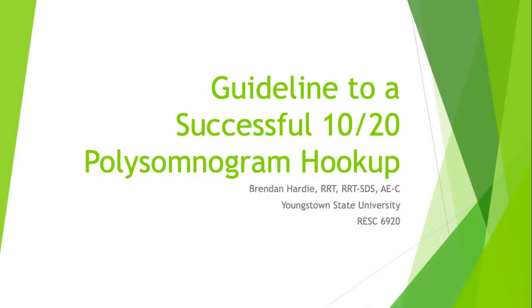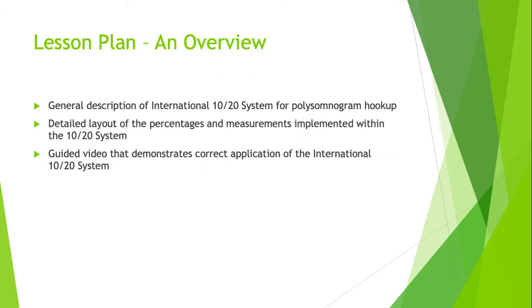Today I will be offering a general guideline towards completing a successful 10-20 hookup for standard polysomnography. As a general overview, we will first be discussing what exactly the International 10-20 system for polysomnography is, where it is derived from, and how to perform the patient hookup process.